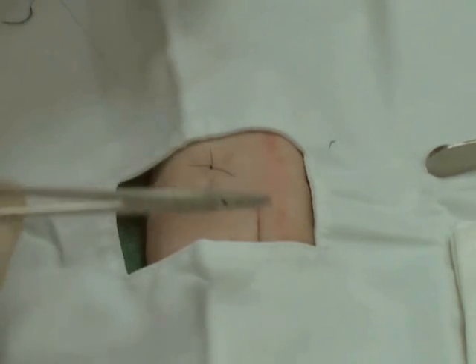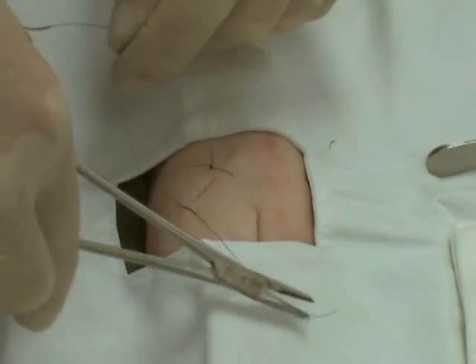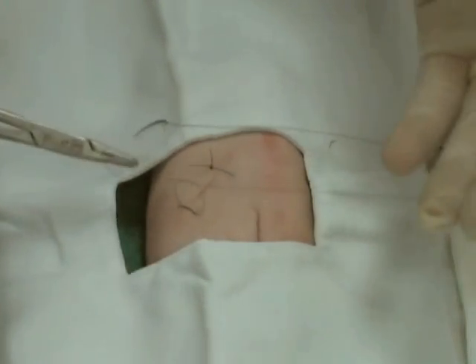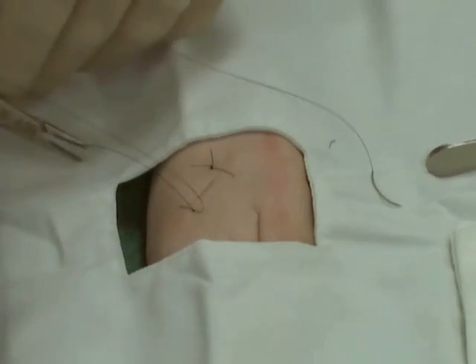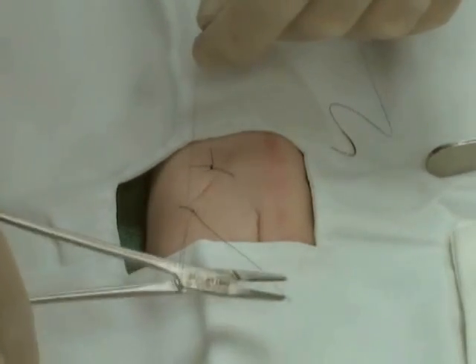Cross your hand and the instrument to allow the knot to lie flat. Again, put the instrument in the middle and cross, and the knot will be flat automatically as you cross your hand and the instrument. With a non-braided suture, four to six throws is adequate.